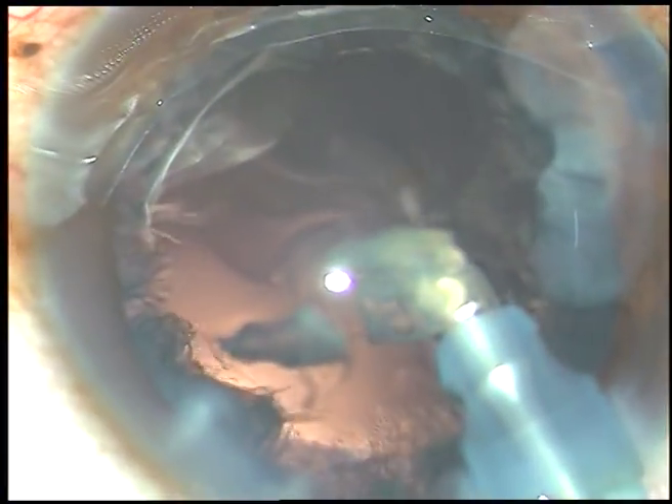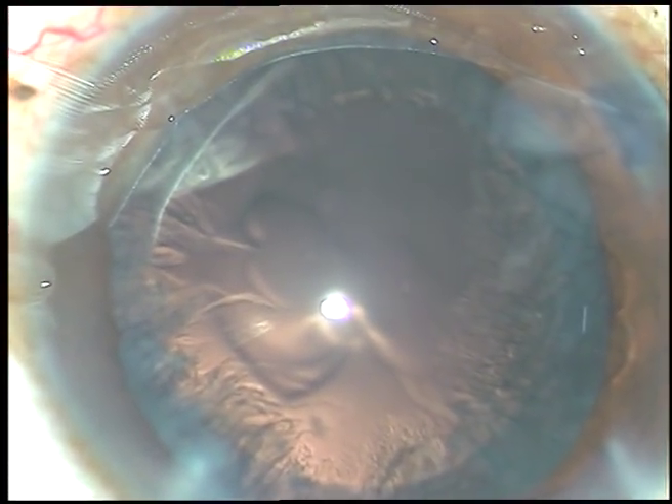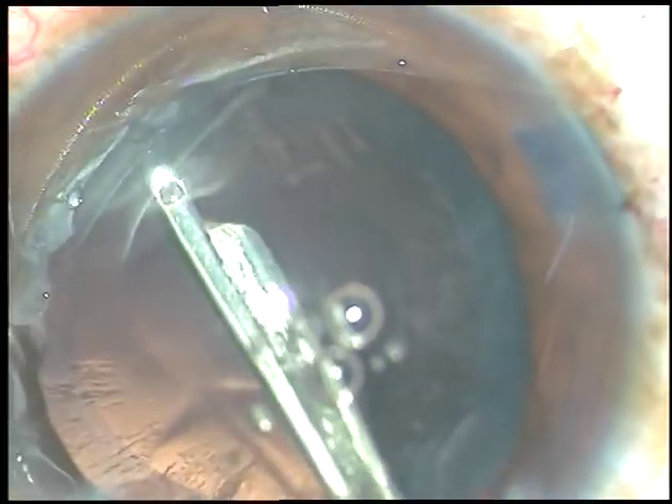The last bit of nucleus is removed while the chopper is taken out of the anterior chamber. That's it — the nucleus is managed. Now, in this case, some cortex remains. Viscoelastic substance is injected and I'm going to use a 23-gauge Simcoe cannula to remove this cortical matter. You can use bimanual IA if you prefer. The reason I use the Simcoe cannula is it works very fast in my hands.